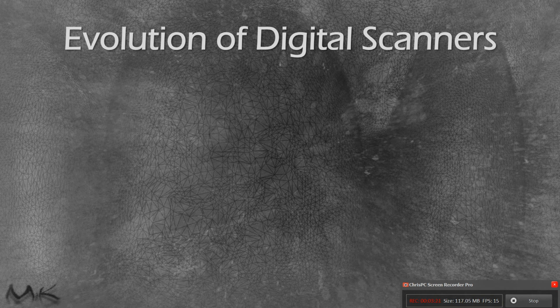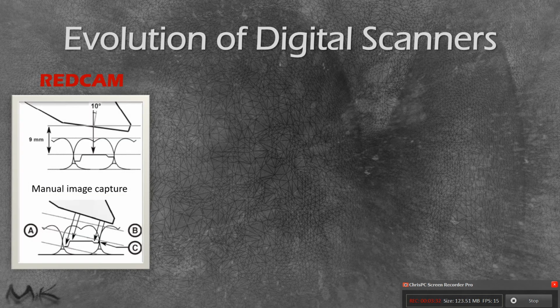But also we have to know how the evolution of our digital scanners actually worked, okay? For this, I'm going to break down just one company. I'm going to look at the evolution of intraoral scanners from Dentsply Sirona. We started with something called the RedCam, something that used a focused beam of light. We had to get very, very close to the tooth, within 9 millimeters. We had to place an anti-reflective coating or a powder on top of the tooth in order to capture an image, because the camera would calculate the speed of the light coming back to the camera, stitch images together, and give us a 3D representation of our tooth.